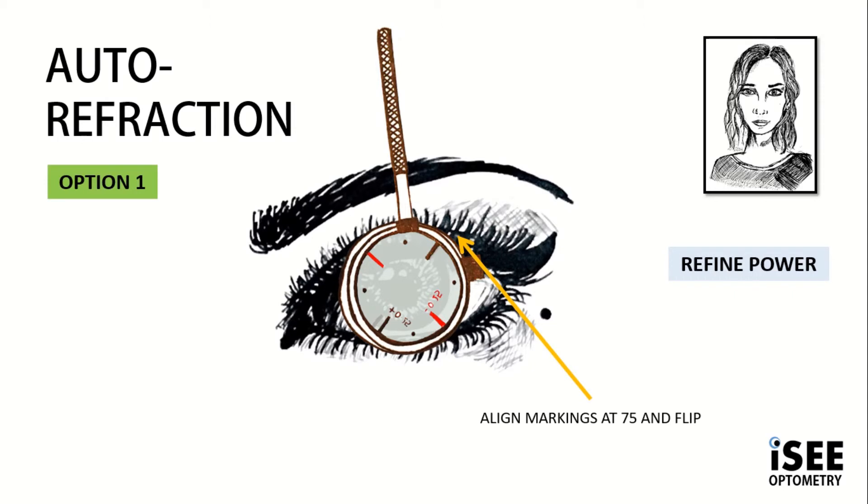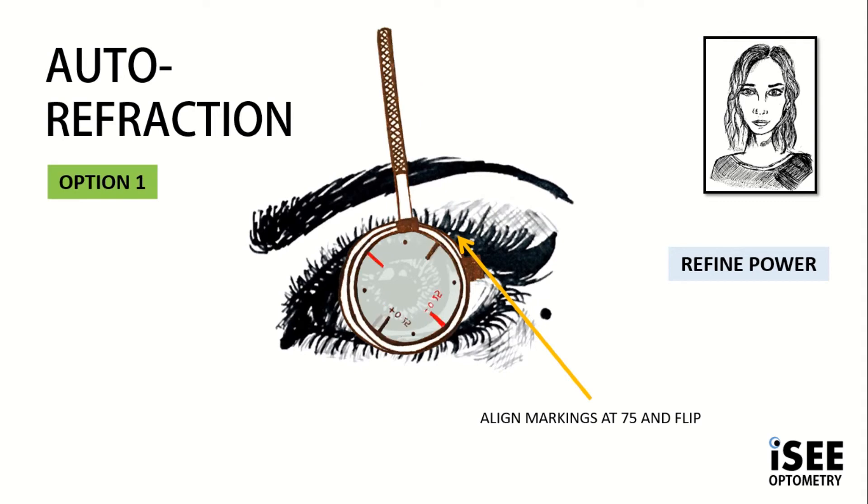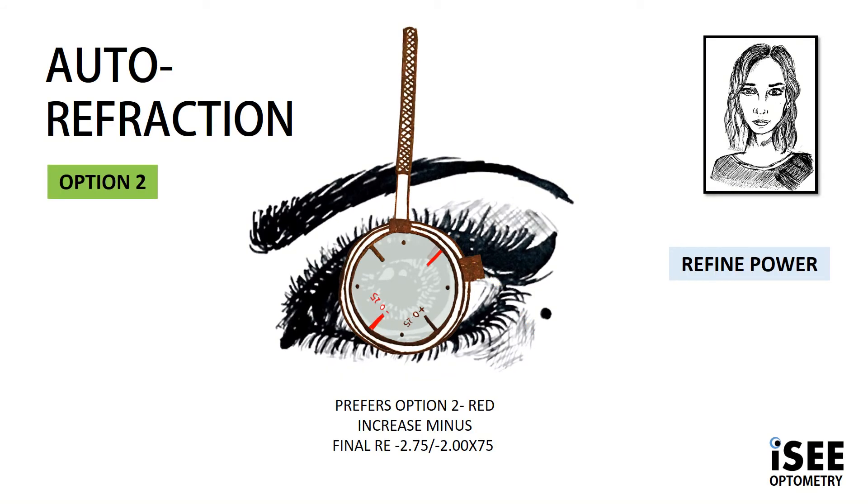Showing Violet her options: option 1 is black — less minus — and option 2 is red — more minus. We continue flipping and asking Violet which one makes it sharper and clearer. In this case, Violet prefers option 2, so we need to increase our minus by 0.25. This brings our final prescription to minus 2.75, minus 2 at 75.